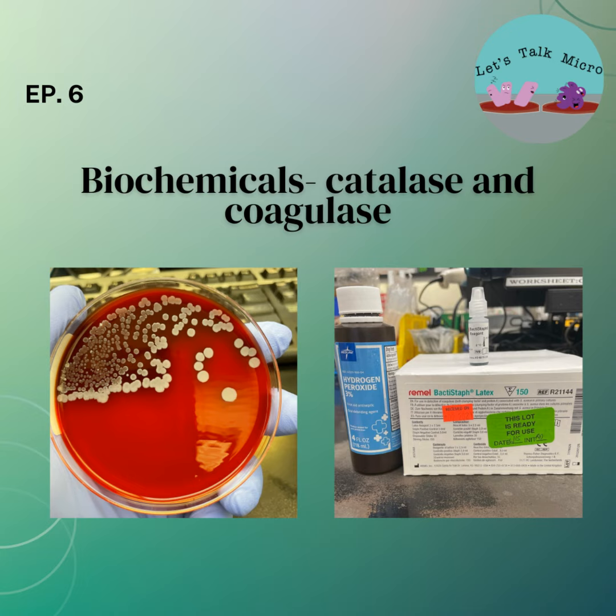So when you have these scenarios, beta hemolytic coagulase negative, or white colonies from the urine bench of a young female, go ahead and do an ID by another method like the Vitek, MALDI-TOF, MicroScan, whatever you use in your lab, because you need to rule out Staphylococcus saprophyticus, which causes UTIs in young females. So there you have it.